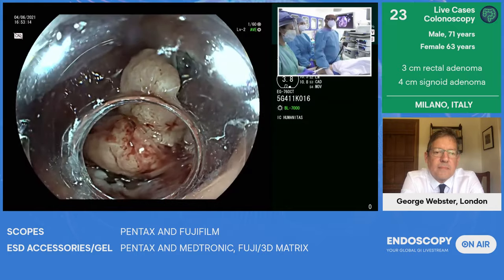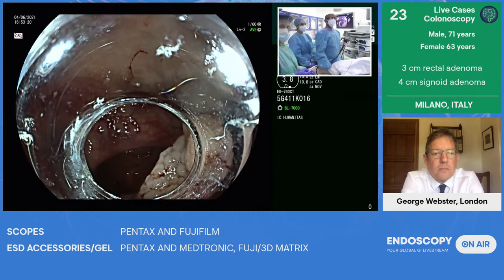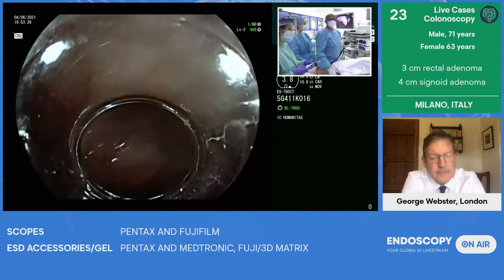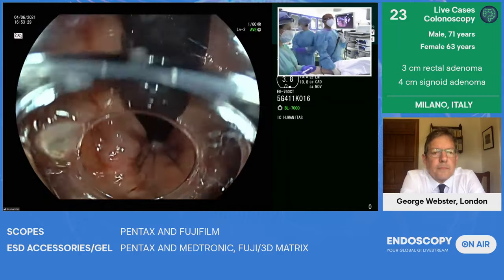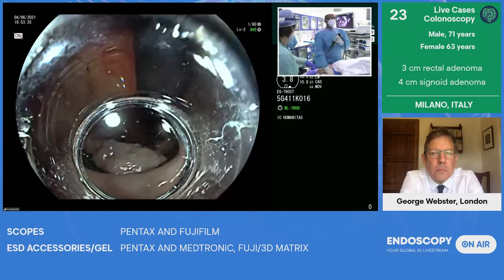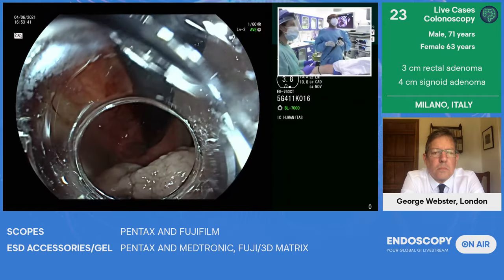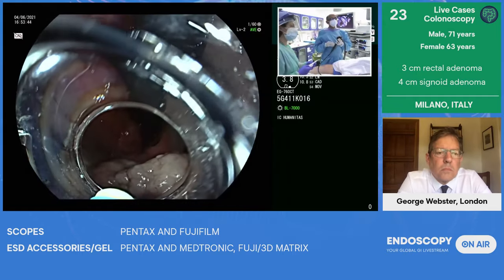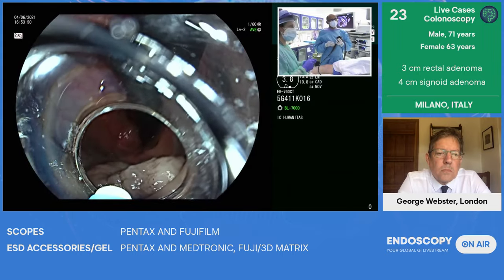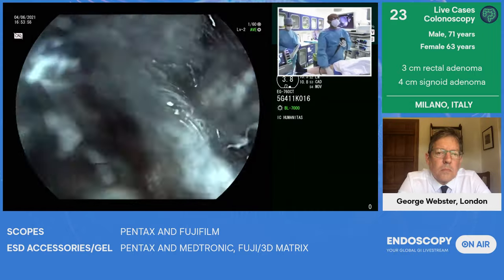I've already done a bit of work in the front and had a lot of bleeding, which we have controlled. Now what I want to do is a circumferential mucosal incision. Once I've done the circumferential incision, we'll deploy some traction device, and you can come back and see how we do that. Here, I'll show you the two functions of the knife quickly. If you show the needle type now, please. Excellent. Get the needle type, no, the other one. It requires a lot of training with the nurses to be very sure.